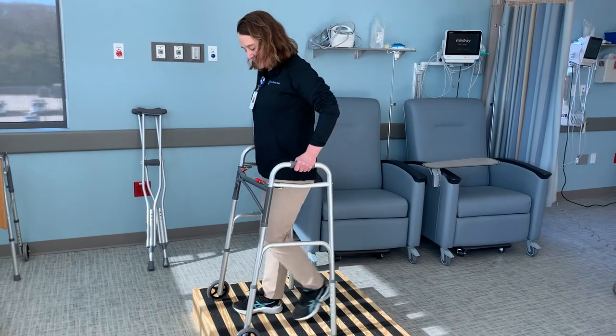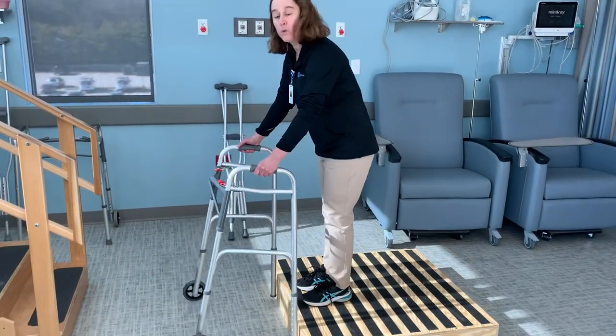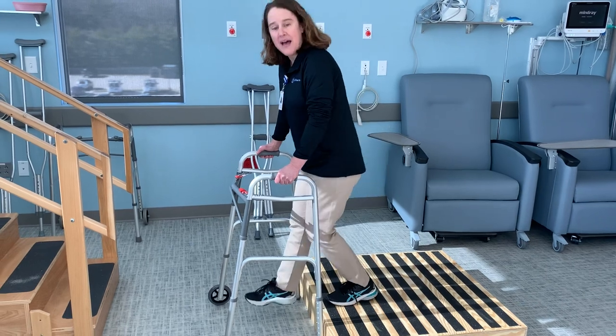When you're going down a step, come right to the edge. The walker will go down first, then down with the bad leg.